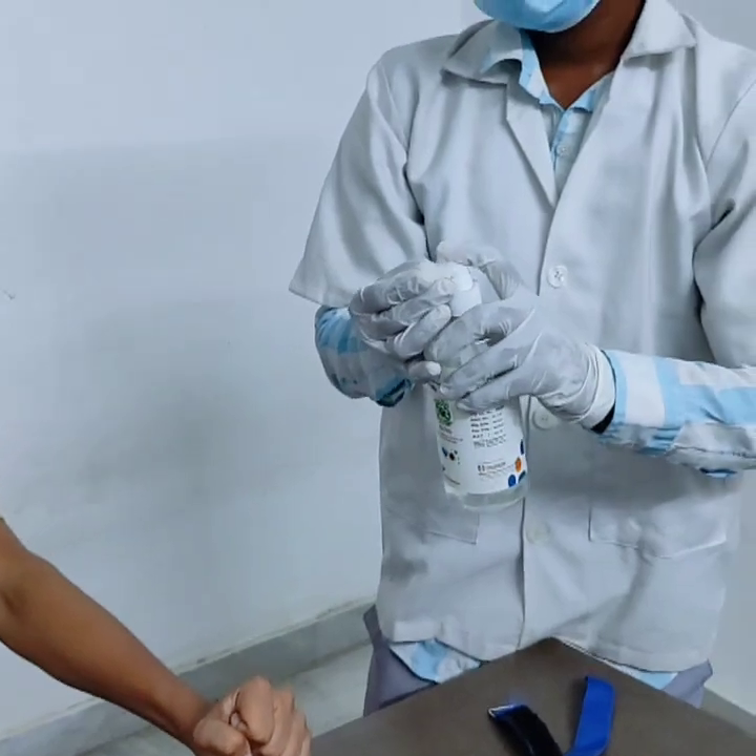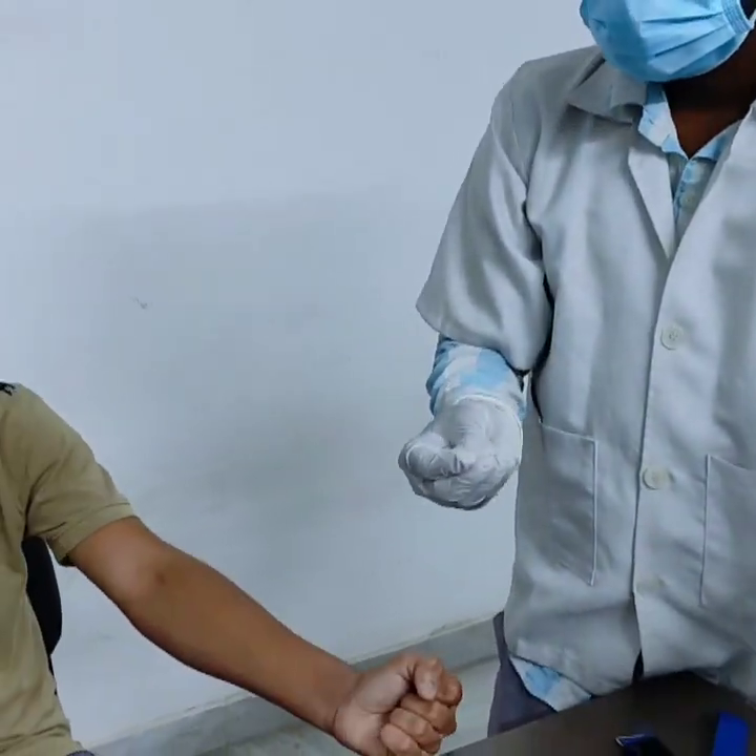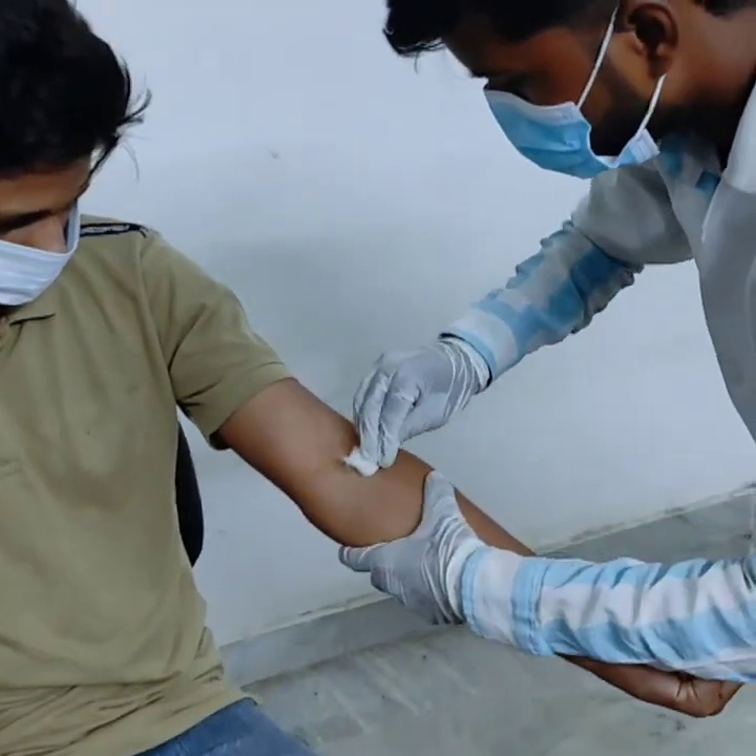A tourniquet, sterile syringe or vacutainer, needle, alcohol swab, blood collection tubes, and cotton.